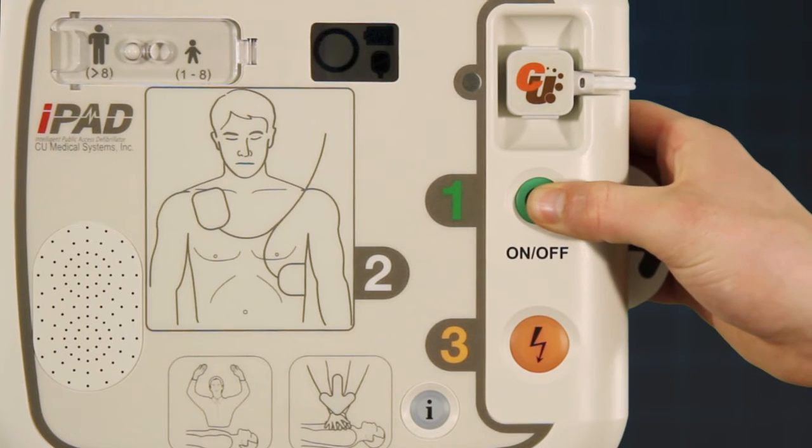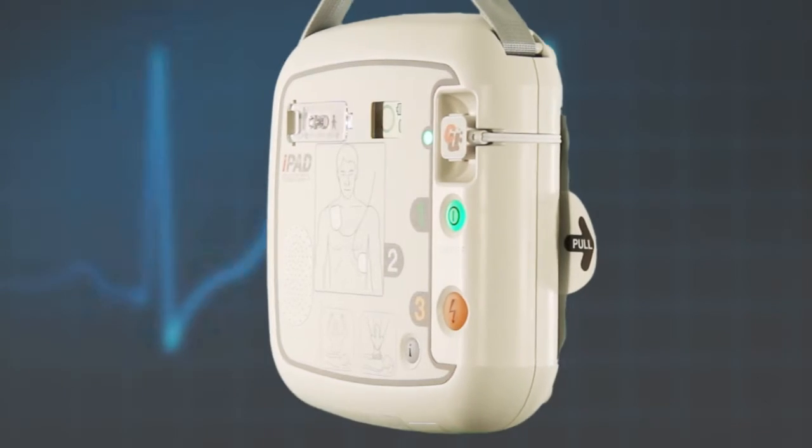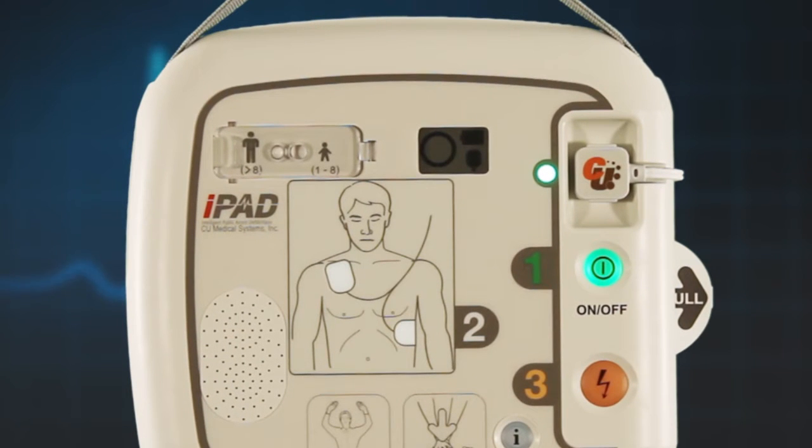To use the AED, first press the green on button. A green light next to the pads connector will illuminate to show if the electrode pads are properly connected. If that light is flashing, please check that the pads are correctly connected to the unit. If the light is constantly lit, the pad connection is good.